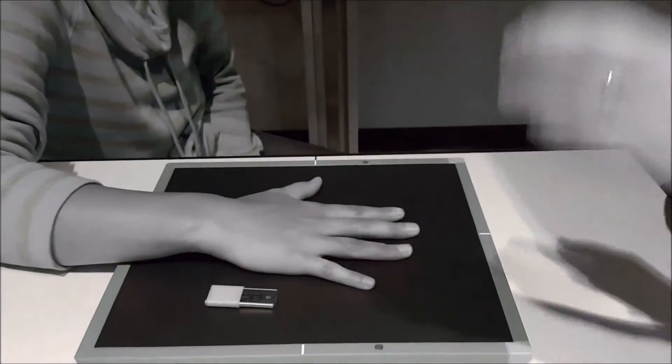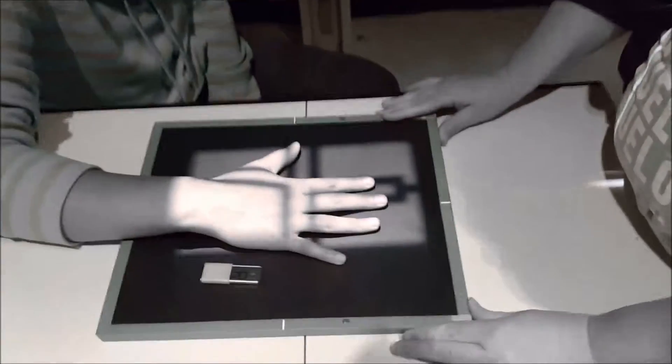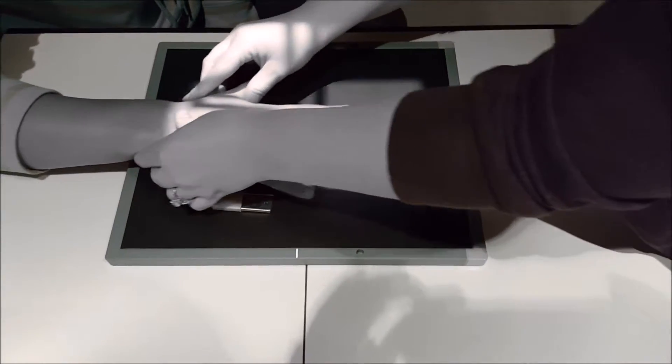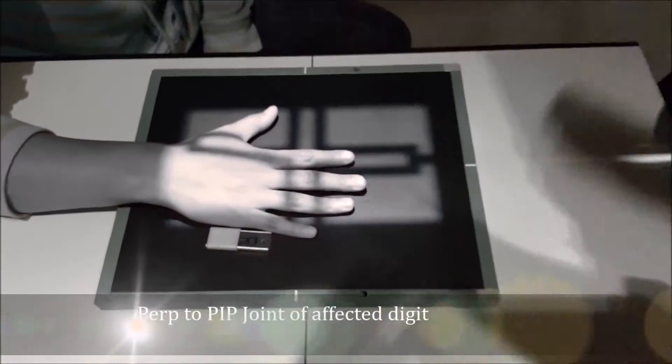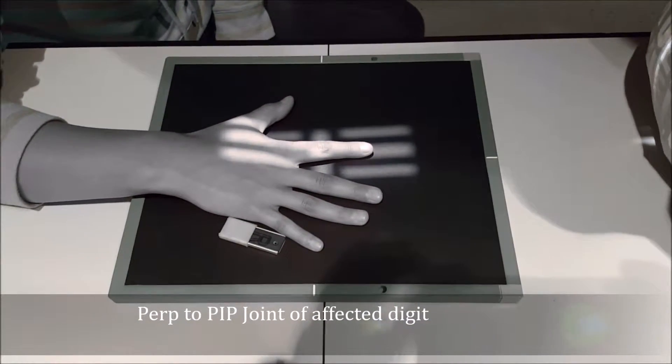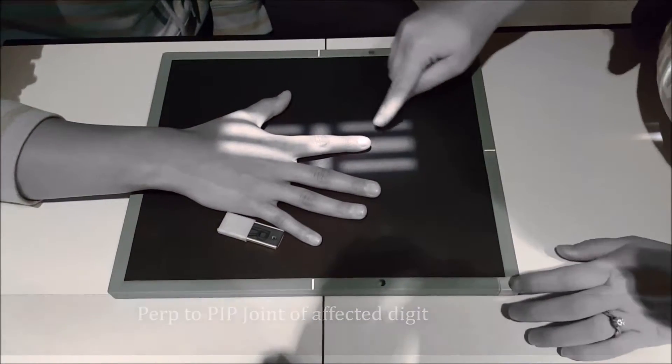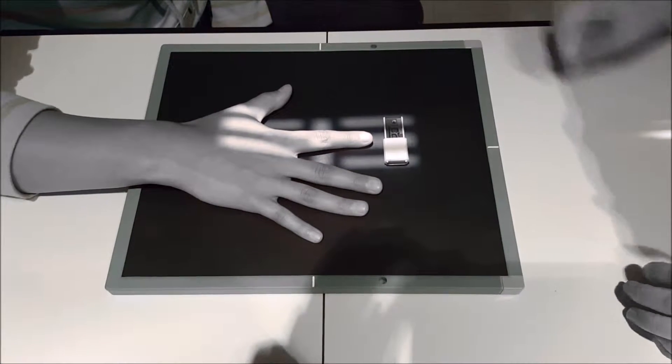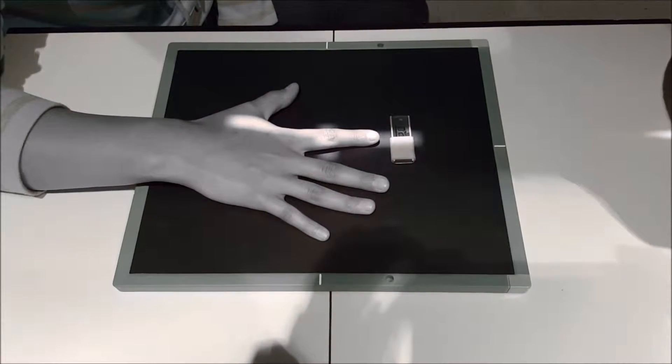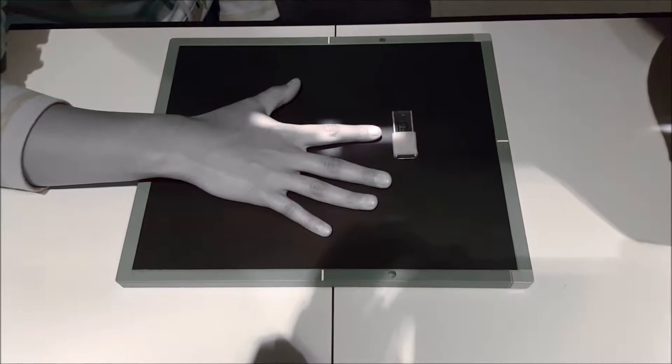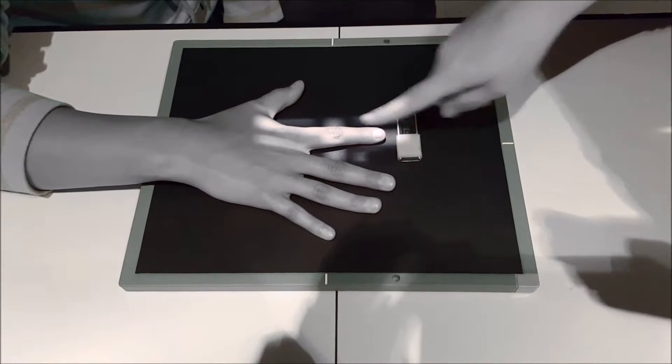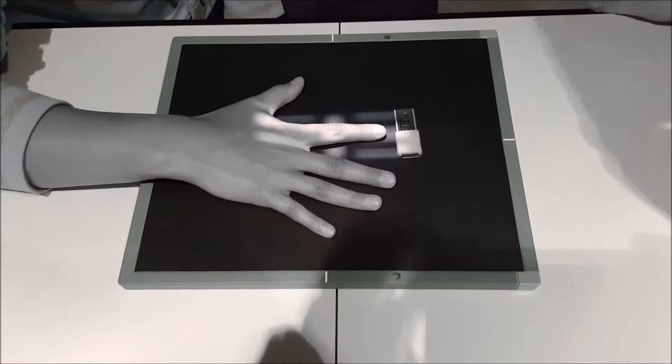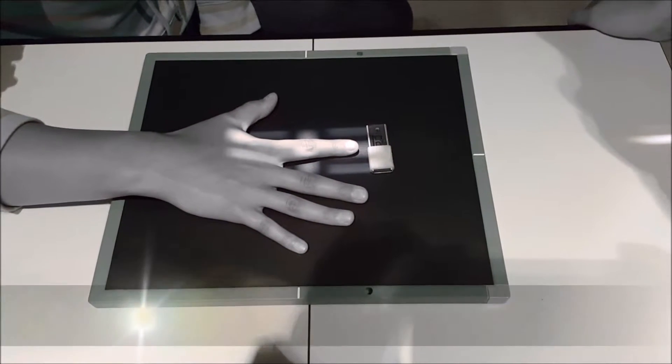For a PA projection of the digit, let me center to the cassette here. You're going to be centered perpendicular to the PIP joint of the affected digit. I like to put my marker just at the top here. I'll leave it open just so you can really see the crosshairs, but this would be a PA projection of the digit.